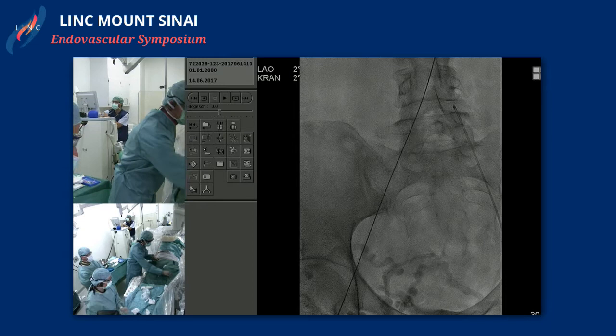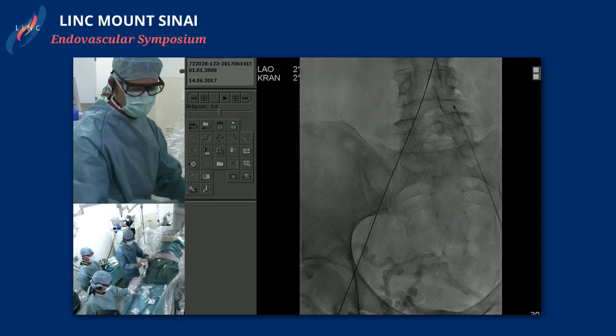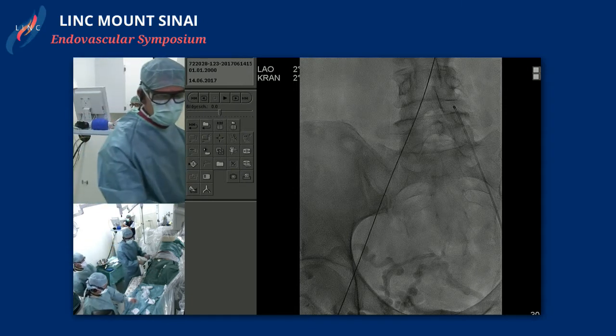Okay, now we can take the sinus oblique stent in. And I show you there are some nice markers which tell you that the oblique part looks in the right direction.